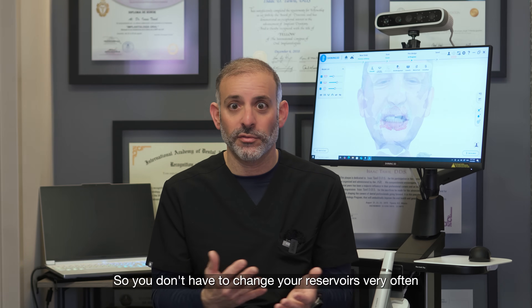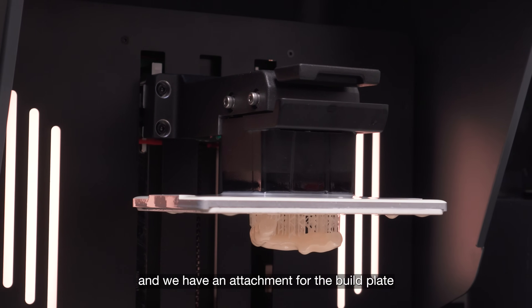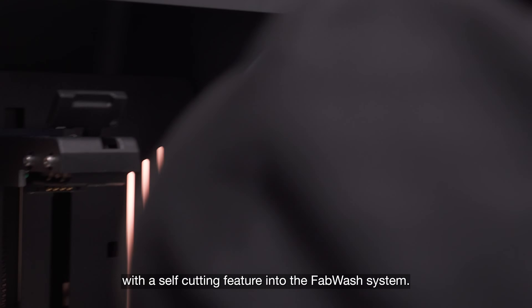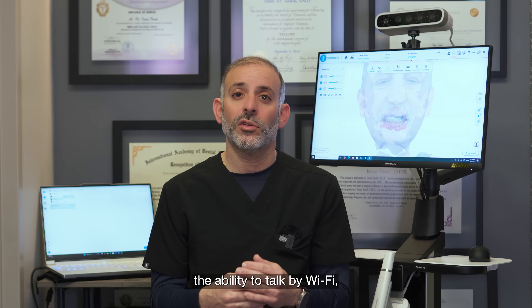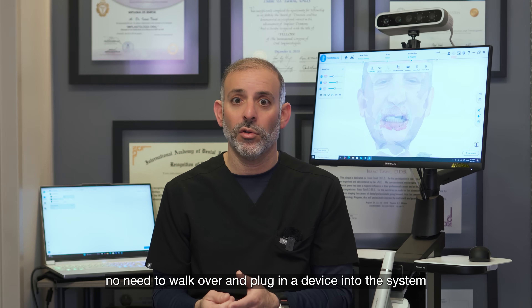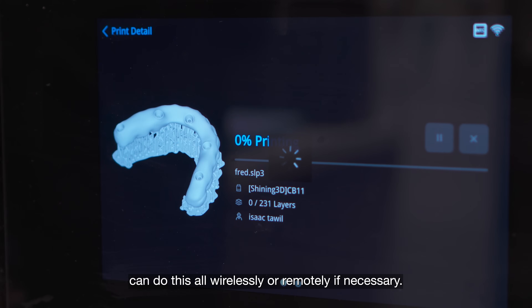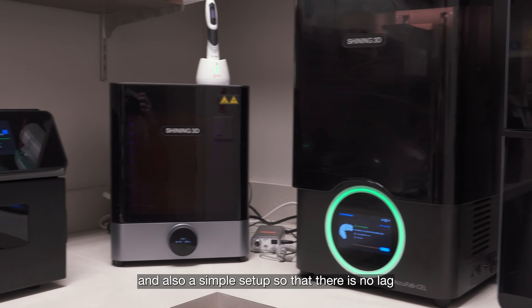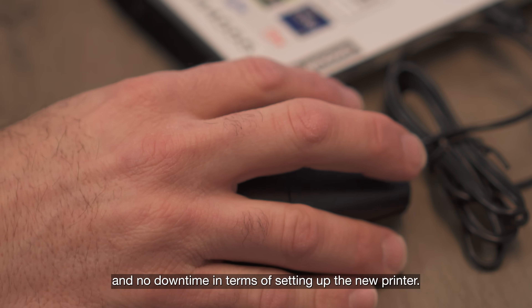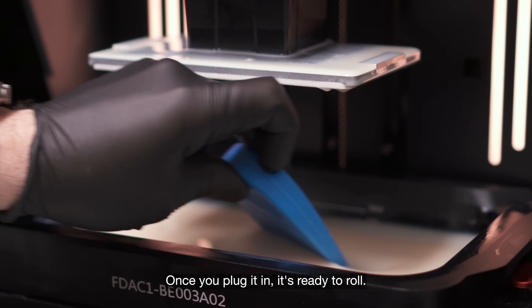The click-in reservoir also enables you to stack resin, so you don't have to change reservoirs very often. The build plate is quite simple, and we have an attachment for the build plate to work with a self-cutting feature into the FAB wash system. That simplicity, that ease of use, the ability to communicate via WiFi — no need to walk over and plug in a device — you can do this all wirelessly or remotely. Once you plug it in, it's ready to roll. Simply load your resin and get printing.